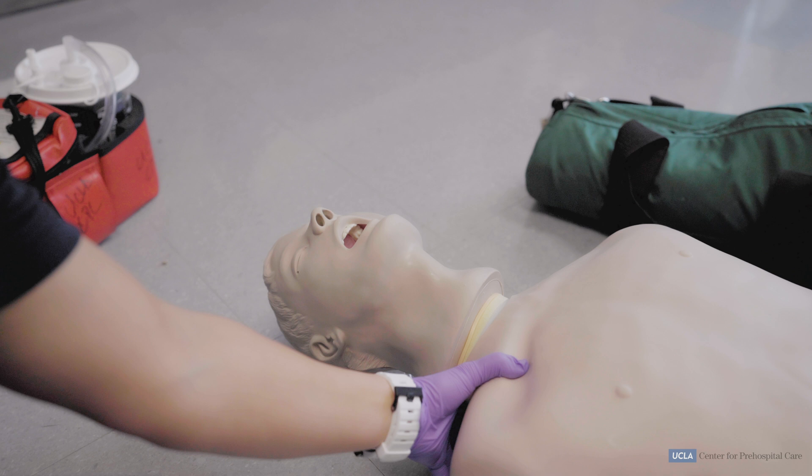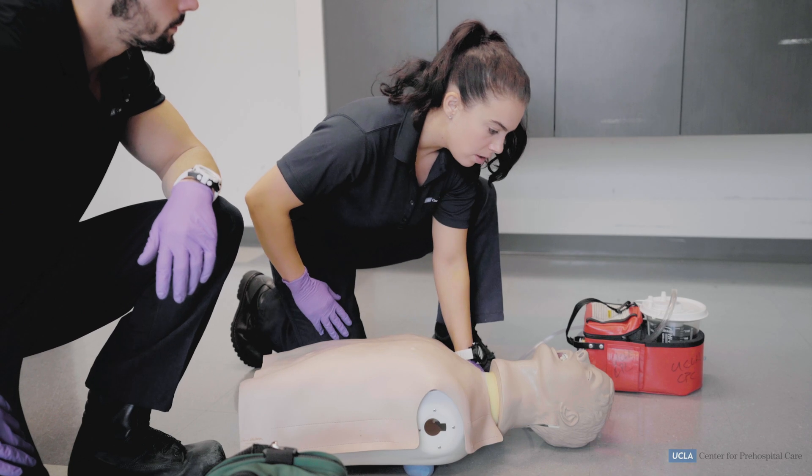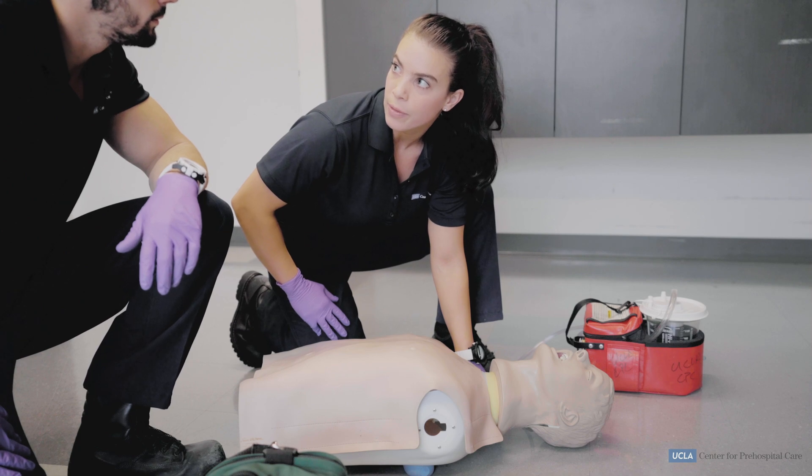Direct partner to call for ALS, get an AED, and come back. Call advanced life support and get an automatic external defibrillator.